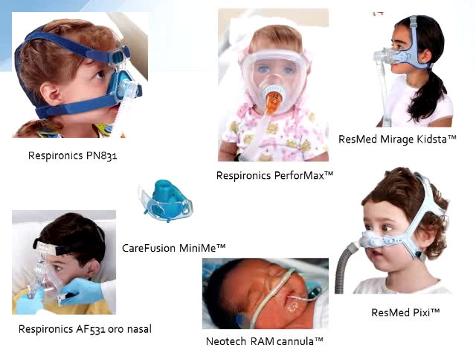Now, my personal bias here is that we have the biggest challenge with preschool age toddler children or early elementary school kids and getting them fit. So finding an interface that actually fits them, but also a headgear that actually fits them. We've got some kids that maybe we can get a mask on, but the headgear is so large that we feel like we almost want to wrap it around their head a couple of times before we get the Velcro to match up. So that probably isn't going to work for them. So it has to be both the headgear and the interface that works well for that child, and sometimes finding that perfect combination can be really, really difficult.